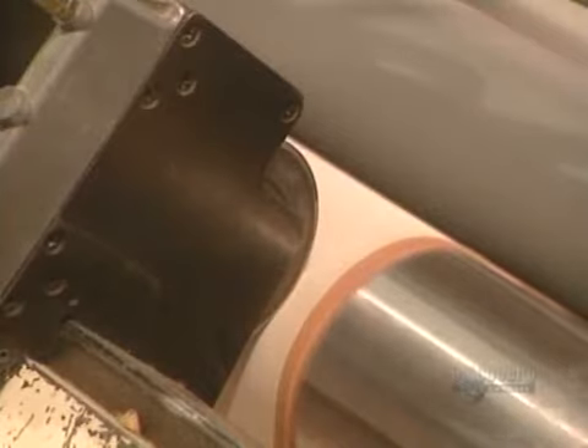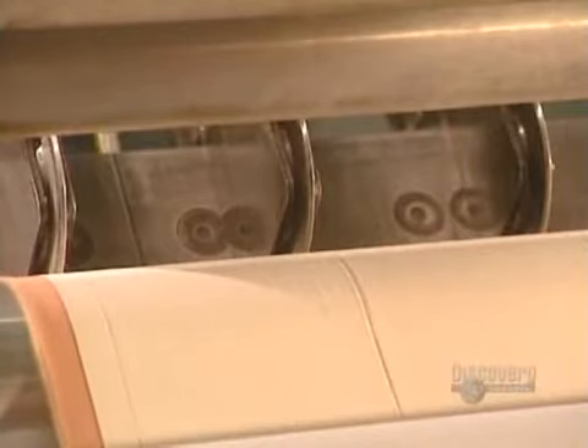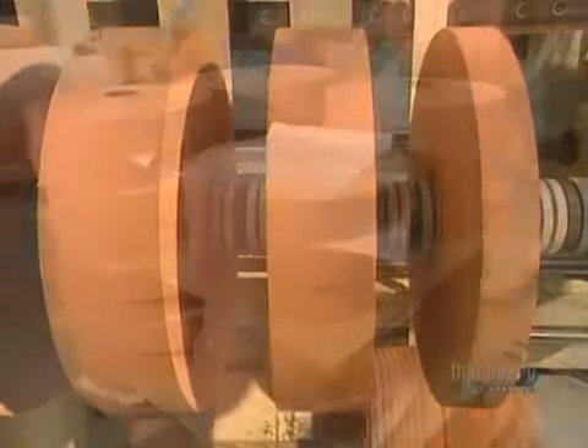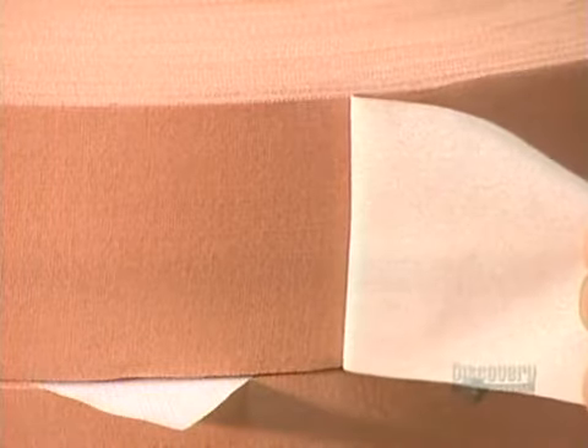Bandages are of different sizes. These blades cut the glued rolls into strips of varying widths. The rolls are then taken away and stacked, ready for the next step: application of the little cushioned protective pads.